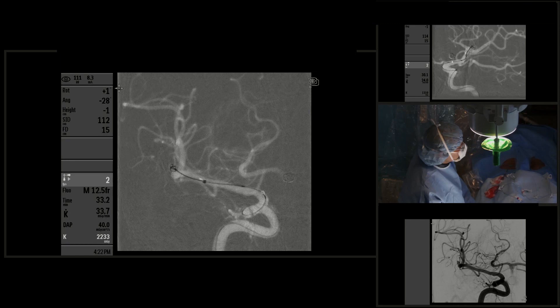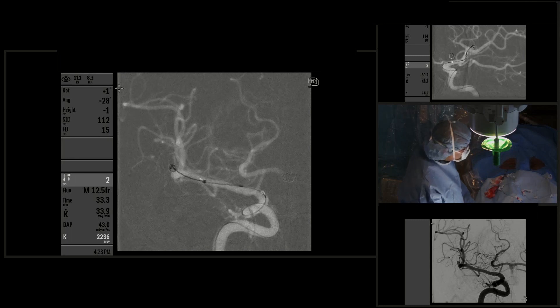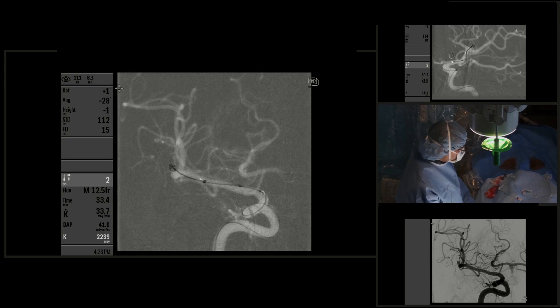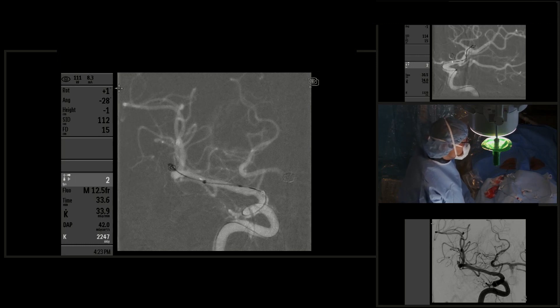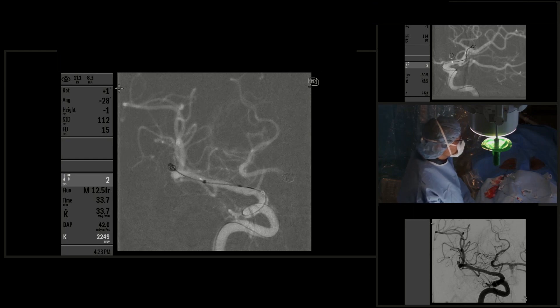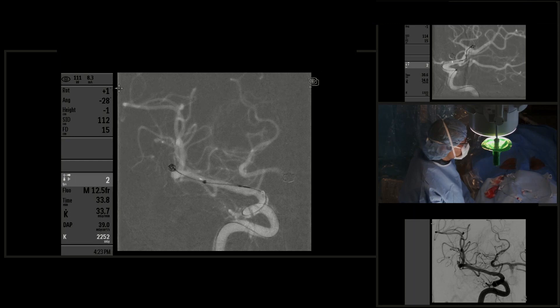We see one loop protruding, but just by pulling back on the coil and advancing again into the aneurysm, we're able to keep the coil mass outside the parent artery and occluding the aneurysm pouch. We were able to place a total of two coils into this aneurysm. The second coil was a Hypersoft 3D 2 millimeter by 2 centimeter coil, advancing very slowly so that we don't disrupt the position of the first coil and don't protrude into the parent artery.